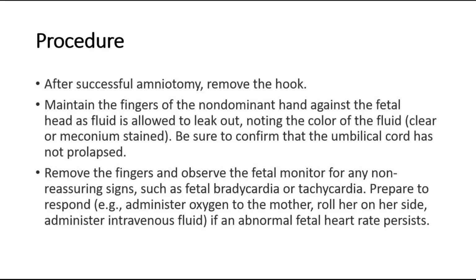Then remove the fingers slowly and start observing the fetal monitor for any non-reassuring signs on the CTG, such as fetal bradycardia or tachycardia. So prepare to respond if there is an abnormal fetal heart rate.